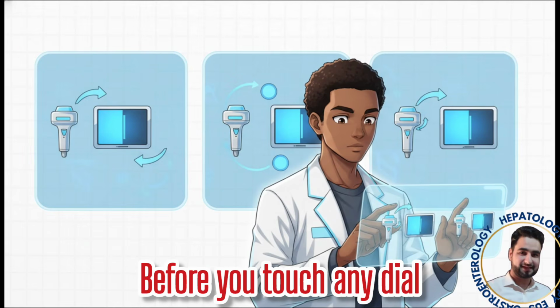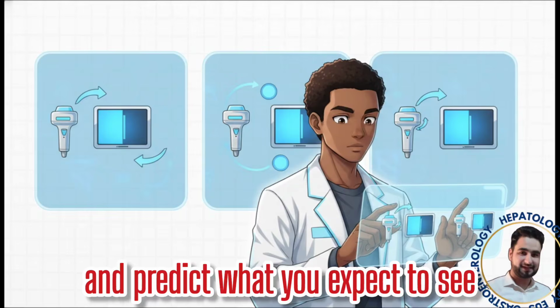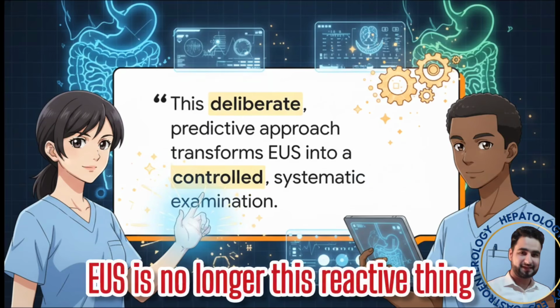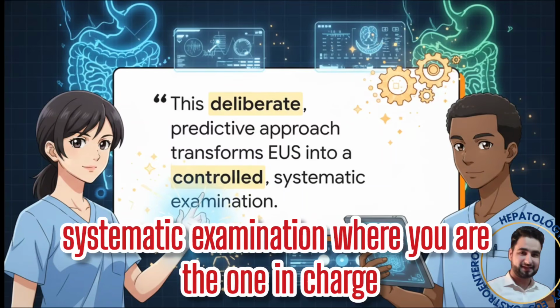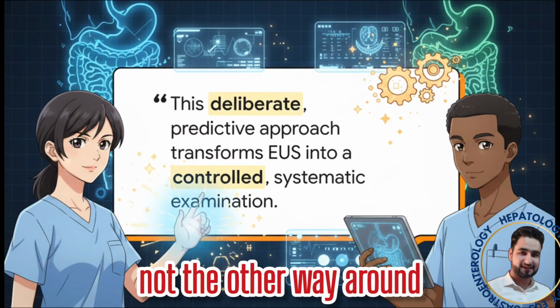Before you touch any dial or move the scope, just take a half second, pause, and predict what you expect to see. Because when you start doing that, you completely change the nature of the procedure. EUS is no longer this reactive thing where you're just hunting for stuff. It becomes a controlled, systematic examination where you are the one in charge. You're telling the image what to do, not the other way around.